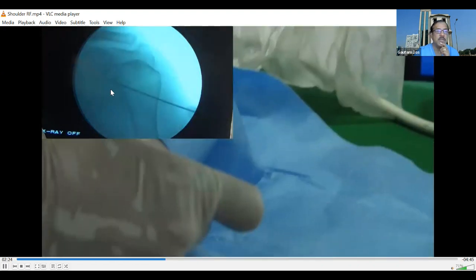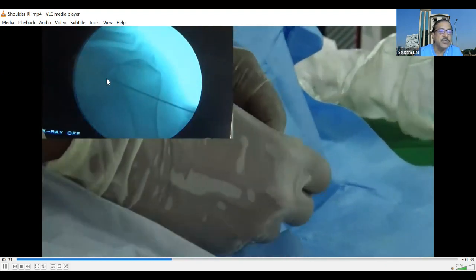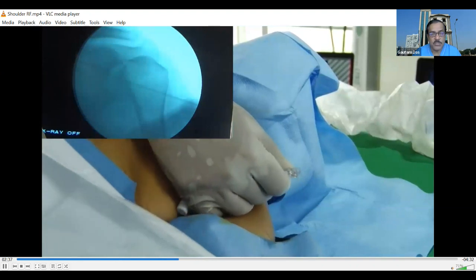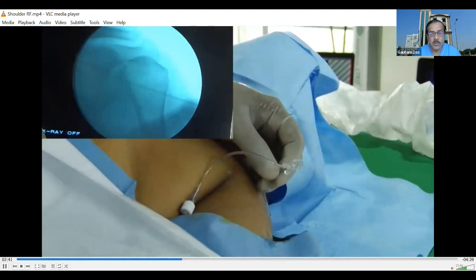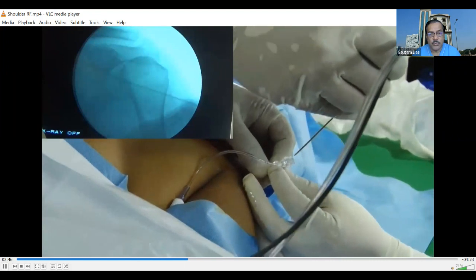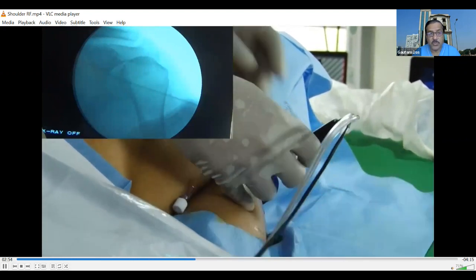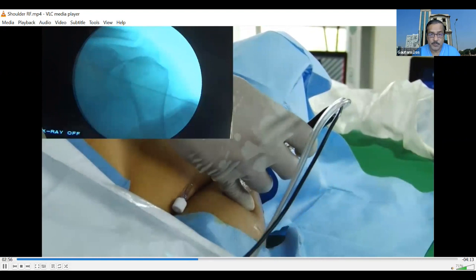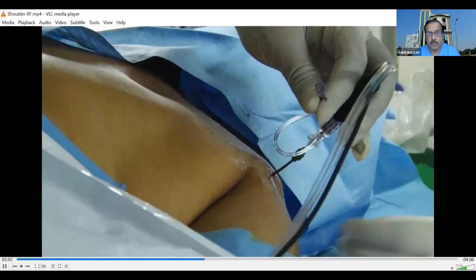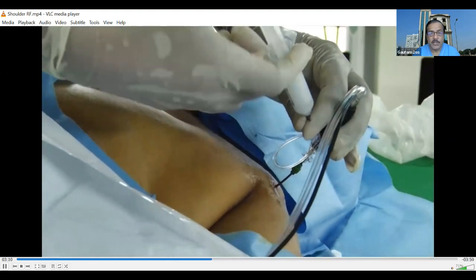We confirm position by fluoroscopy — we can see the spinoglenoid notch and confirm we are right at our target. After that, we perform sensory stimulation; the patient should feel sensation along the posterior aspect of the shoulder joint. We then inject local anesthetic and perform thermal heat lesioning. The tip temperature is maintained at 60 degrees Celsius, and surrounding structures will reach up to 80 degrees. Finally, we again confirm needle position and after completion of the procedure, inject a small amount of steroid to prevent deafferentation pain.